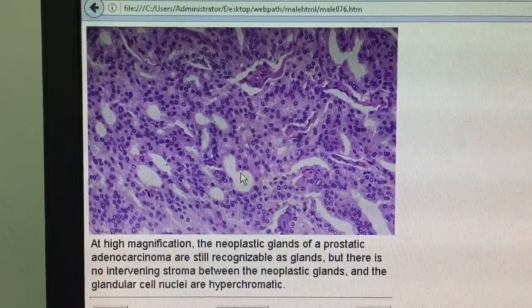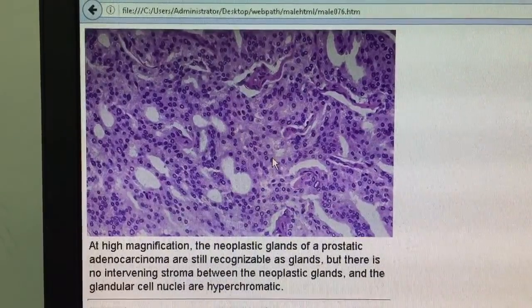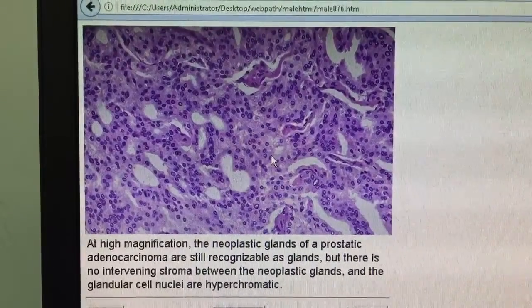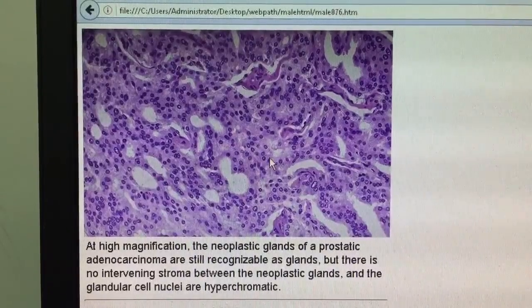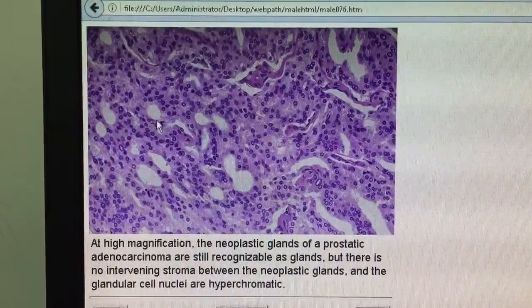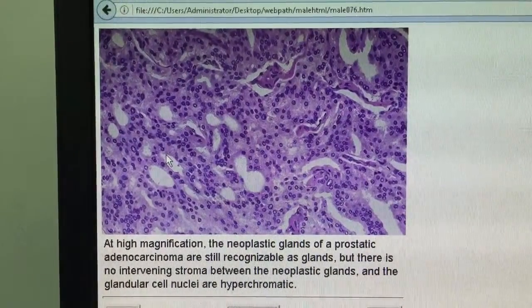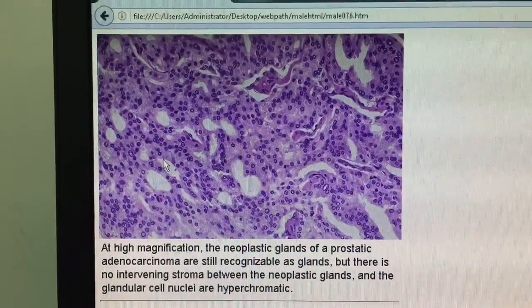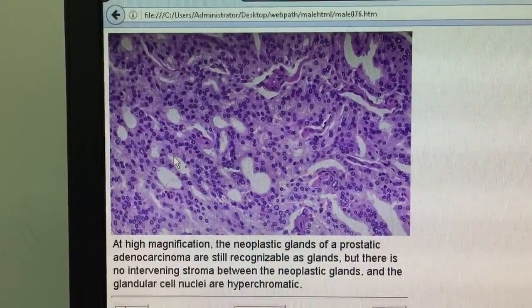We have what we call the Gleason grading system. The Gleason grading system is based on tubular, glandular formation. The more rounded glands we have, the lower the Gleason grade, because they are separated. You can draw a circle around each gland independently, even if they are back to back. Whereas when the glands fuse and open into each other, it becomes Gleason grade 4.